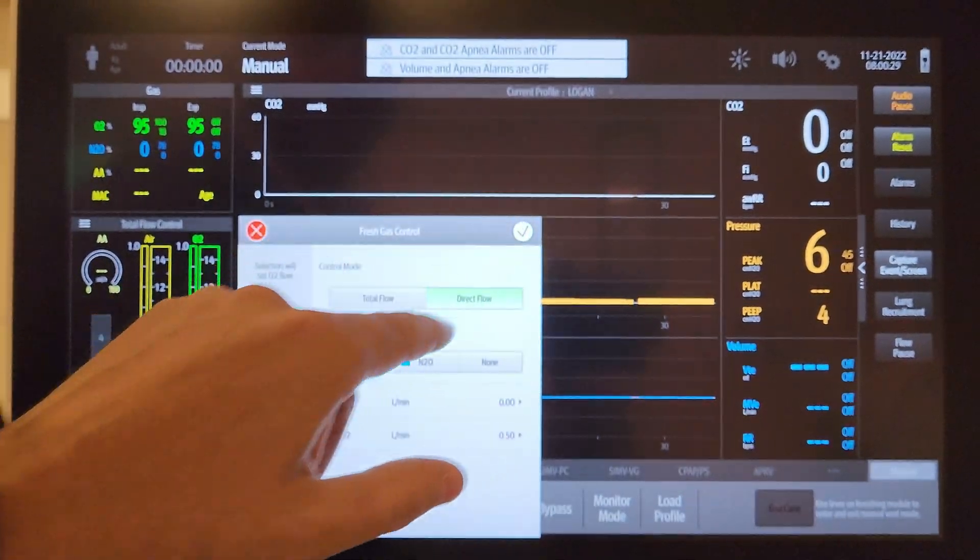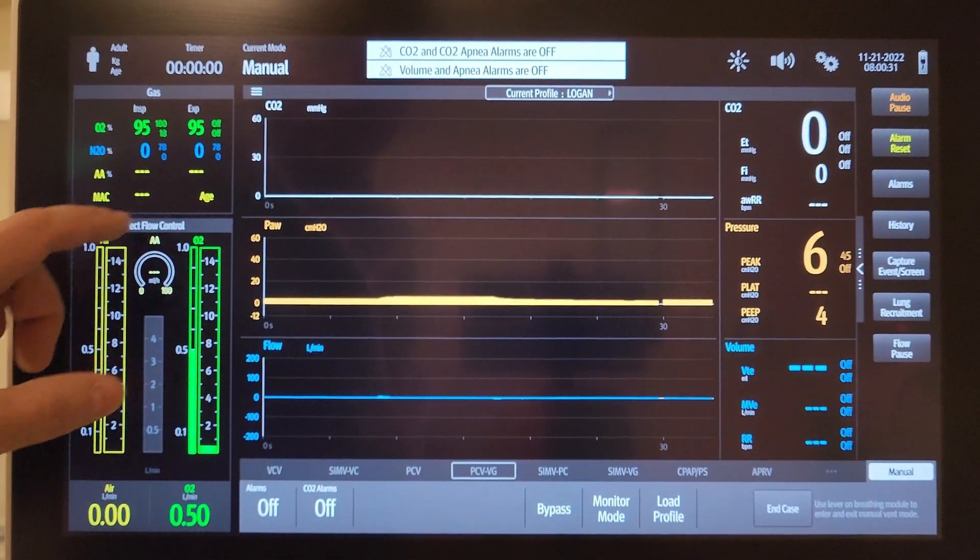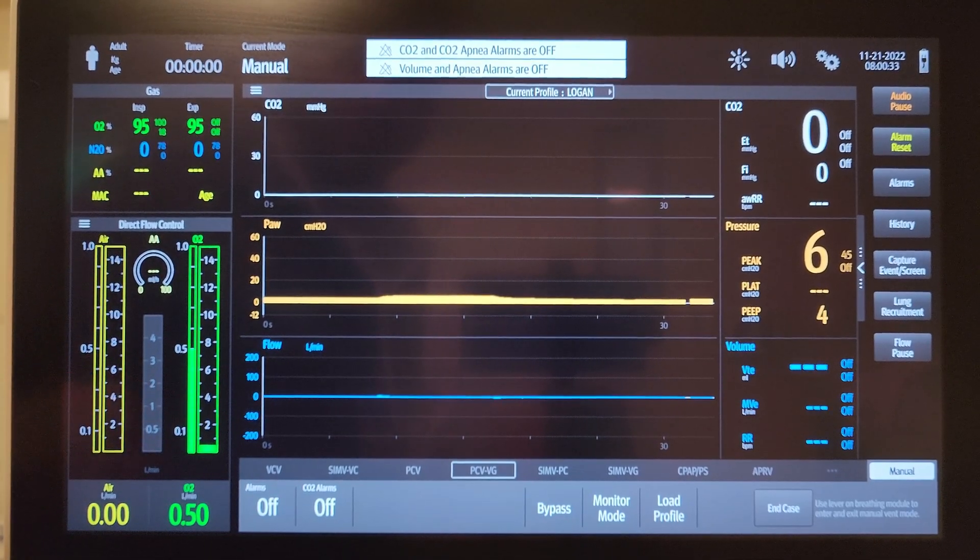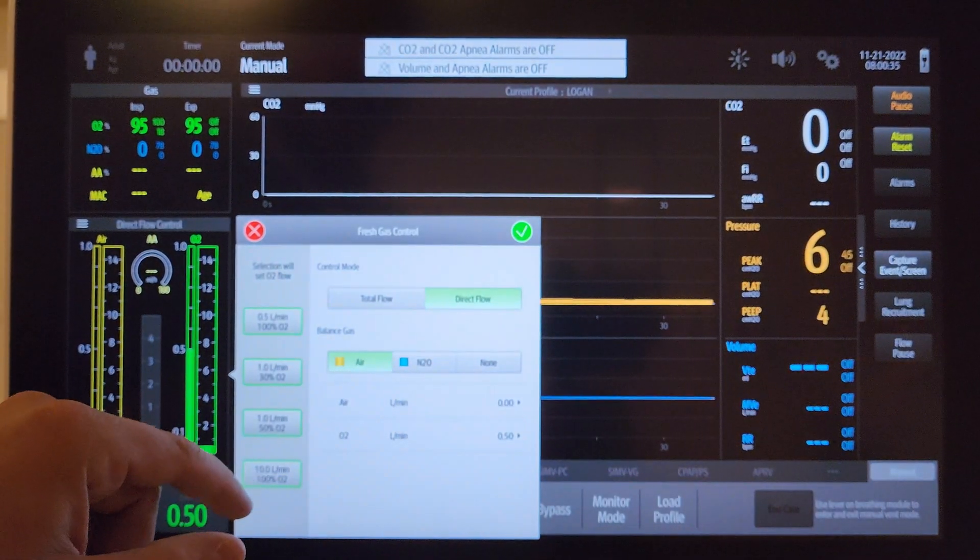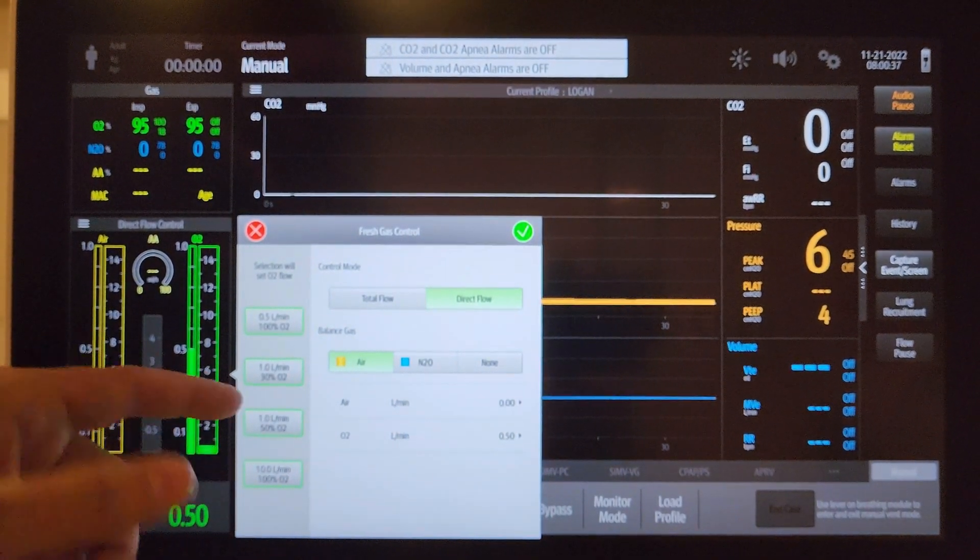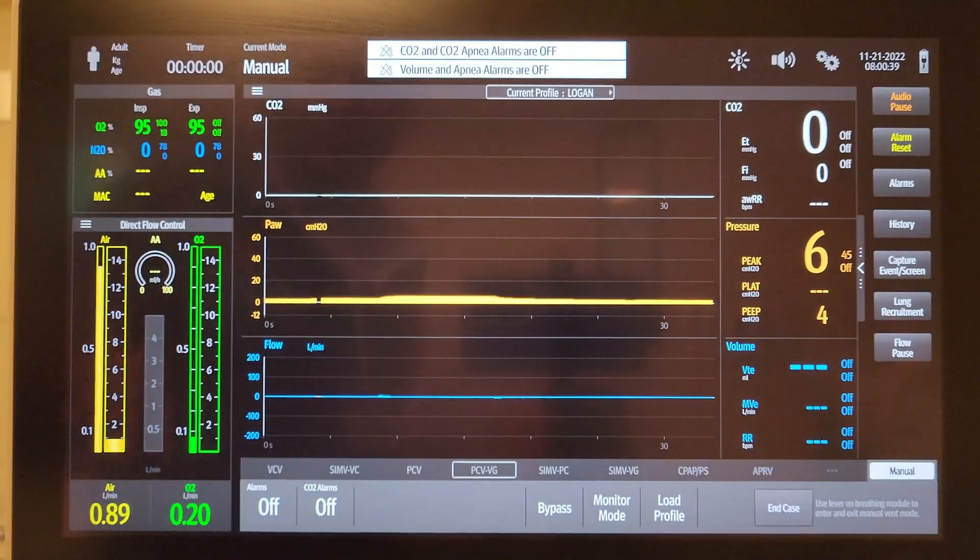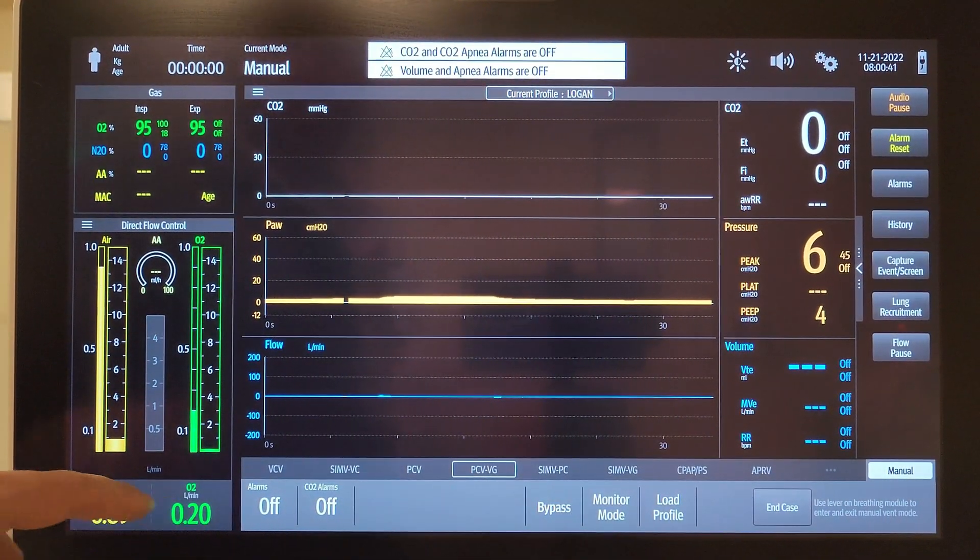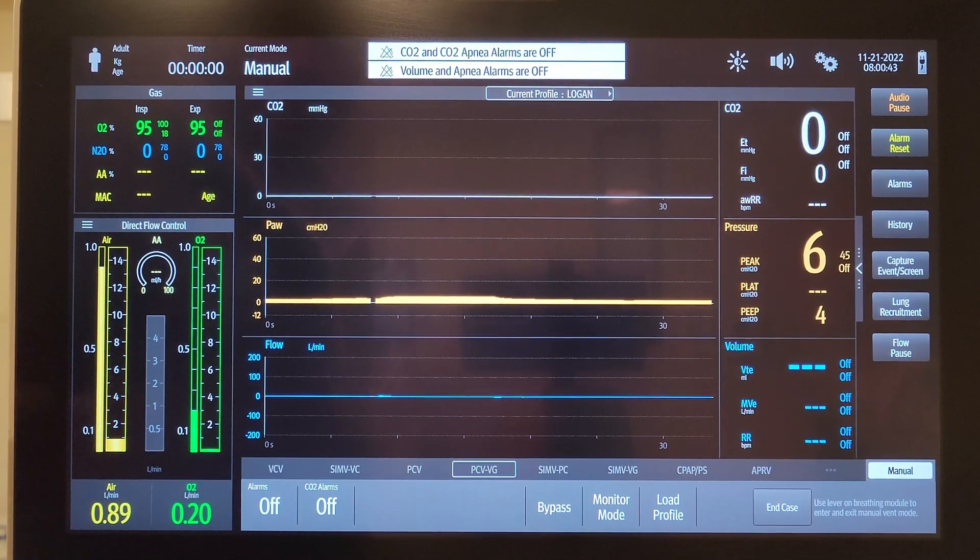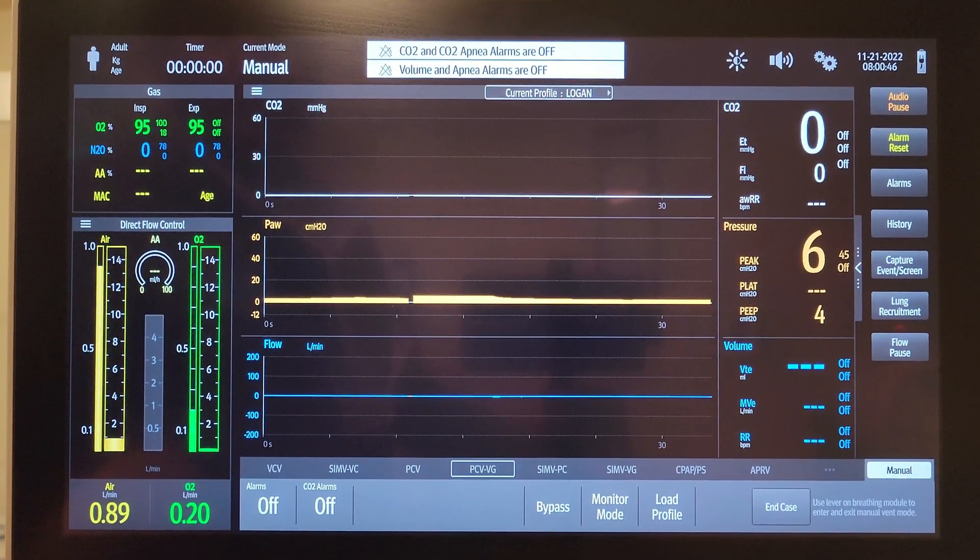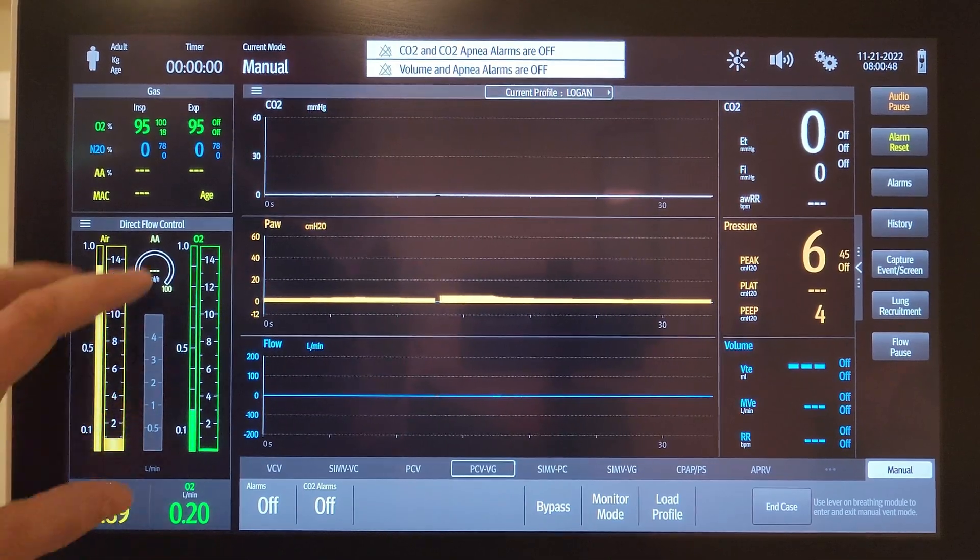I'm going to go back to direct flow because I feel like this is the configuration most people are probably going to use. If I wanted to do one liter with an FiO2 of 30%, I don't see the utility a whole lot, but if you're big into nitrous or something like that you can do that. There's a lot of different options.